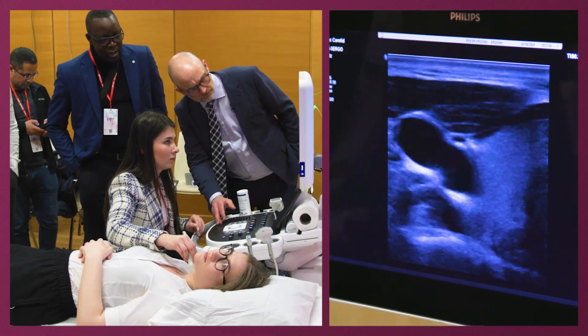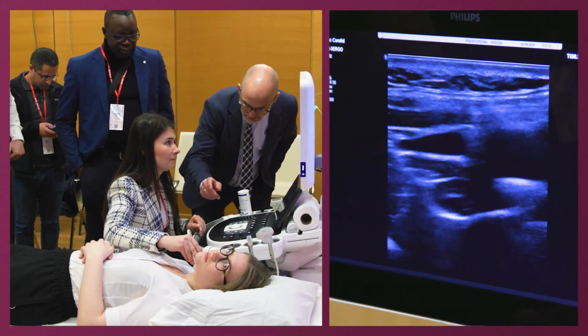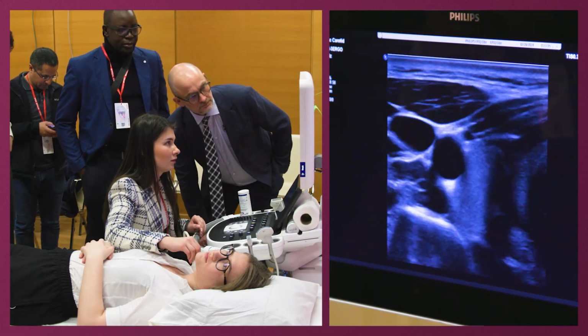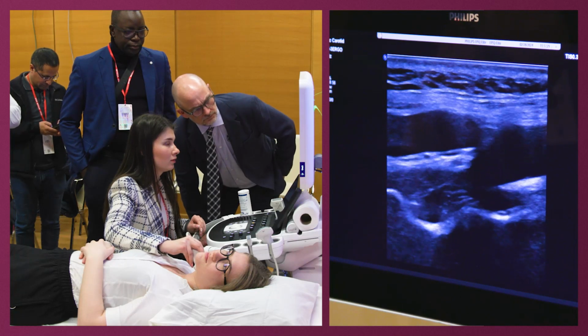Which is, I would say, logical, according to what we normally know. And you see, you are not resting your arm, are you? Okay. So this is what it's doing: moving in that direction from near field to far field.